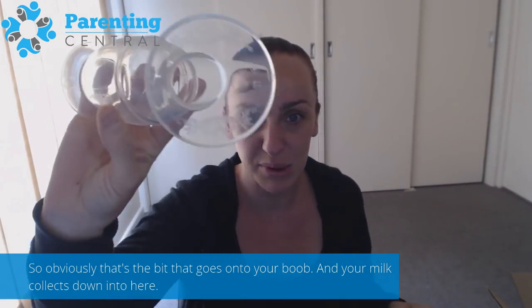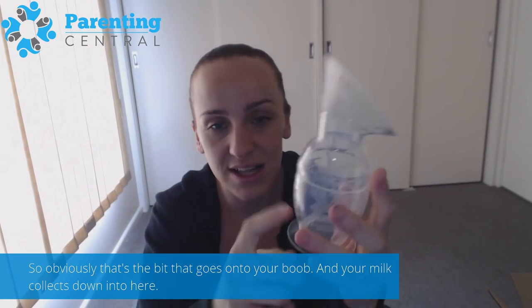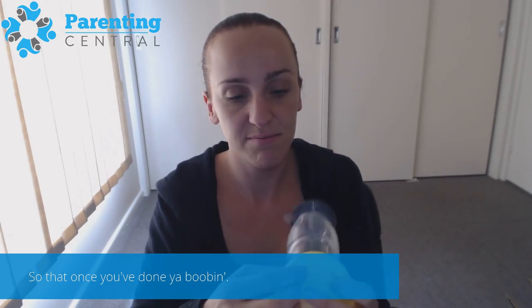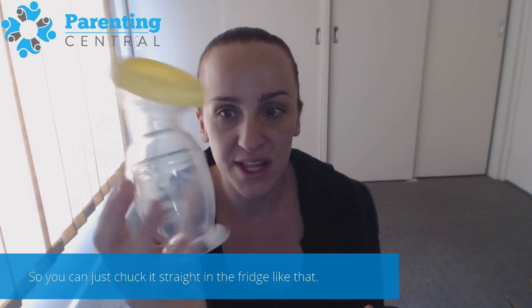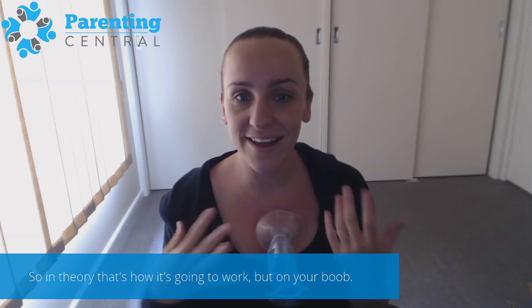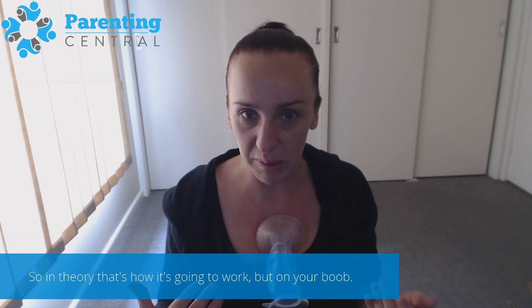It's just soft silicone — that's the part that goes onto your boob — and your milk collects down into here. You can get it with a lid, so once you've done your pumping you can just put it straight in the fridge like that. And it just suctions onto your chest. In theory, that's how it works, but on your boob.